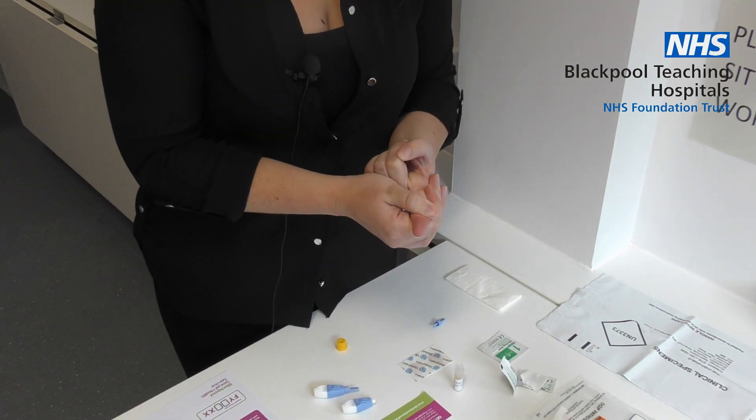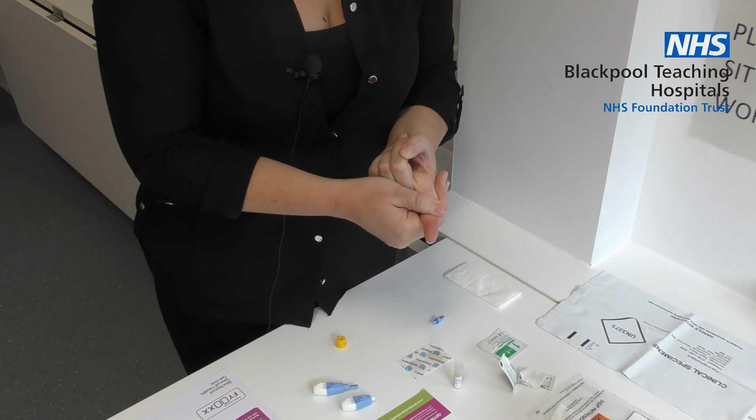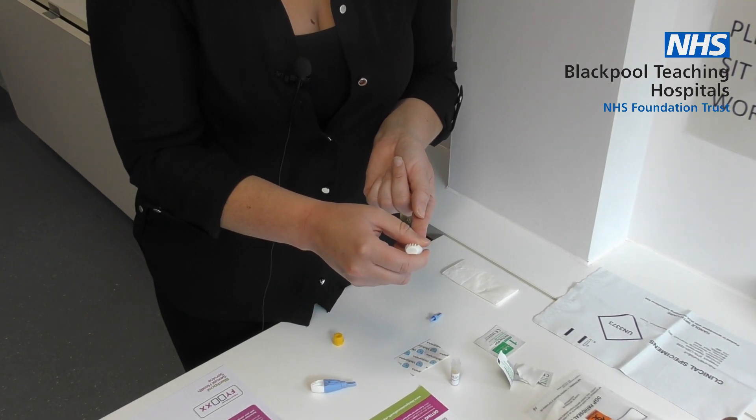Press the top of your finger until the end turns pink. Press the lancet in the tip of the middle of the finger. Push hard and you will feel a small scratch.